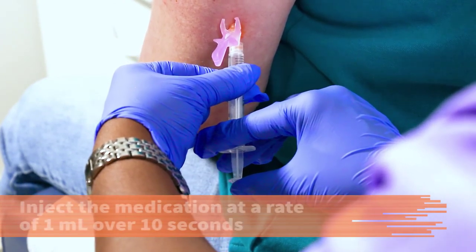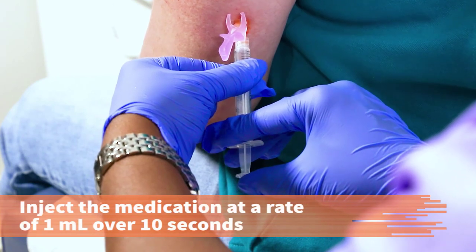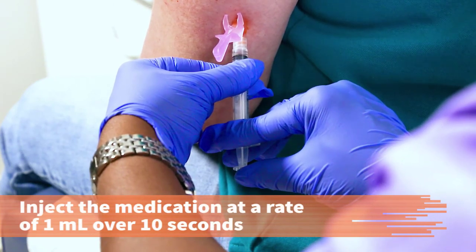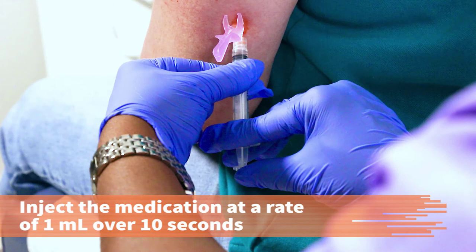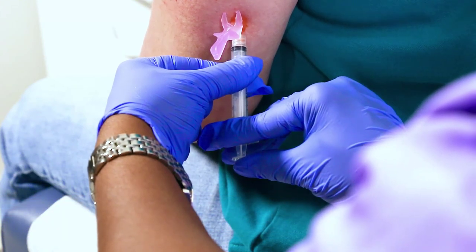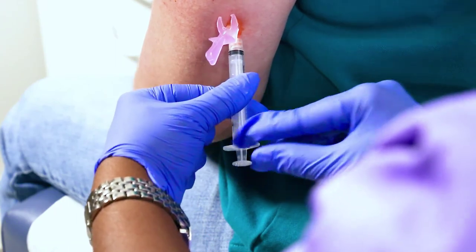Your non-dominant hand should push the plunger to inject the medication at a rate of 1 milliliter over 10 seconds. Ensure all of the medication has been injected before pulling the needle out at the same angle.